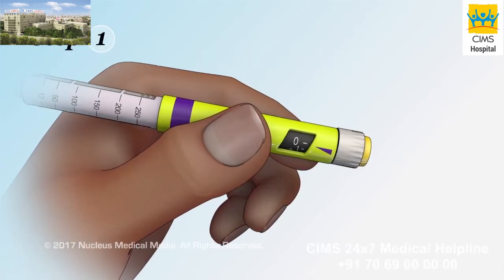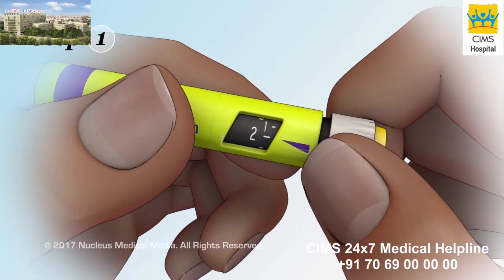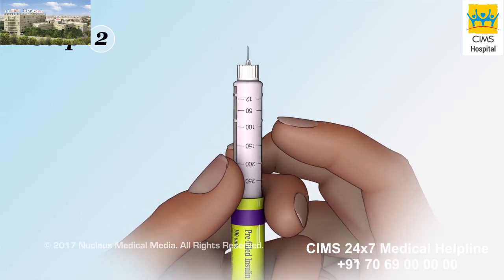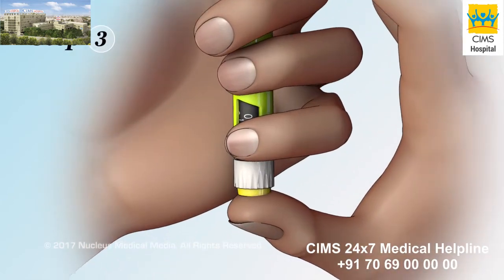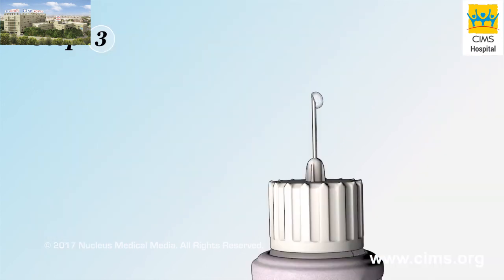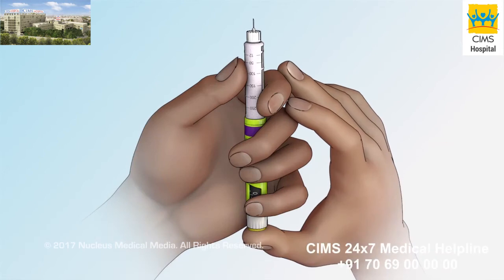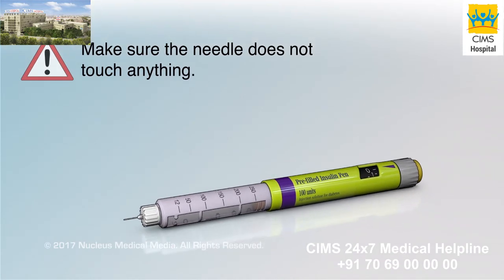Step 1: Turn the dosage dial until you see two units displayed in the dosage indicator. Step 2: Hold the pen with the needle pointing up, and gently tap the end of the pen near the needle two or three times. Step 3: Press the injection button all the way in until a drop of insulin appears on the tip of the needle. You may need to repeat steps one through three before seeing insulin appear. If you need to set your pen down, make sure the needle does not touch anything.